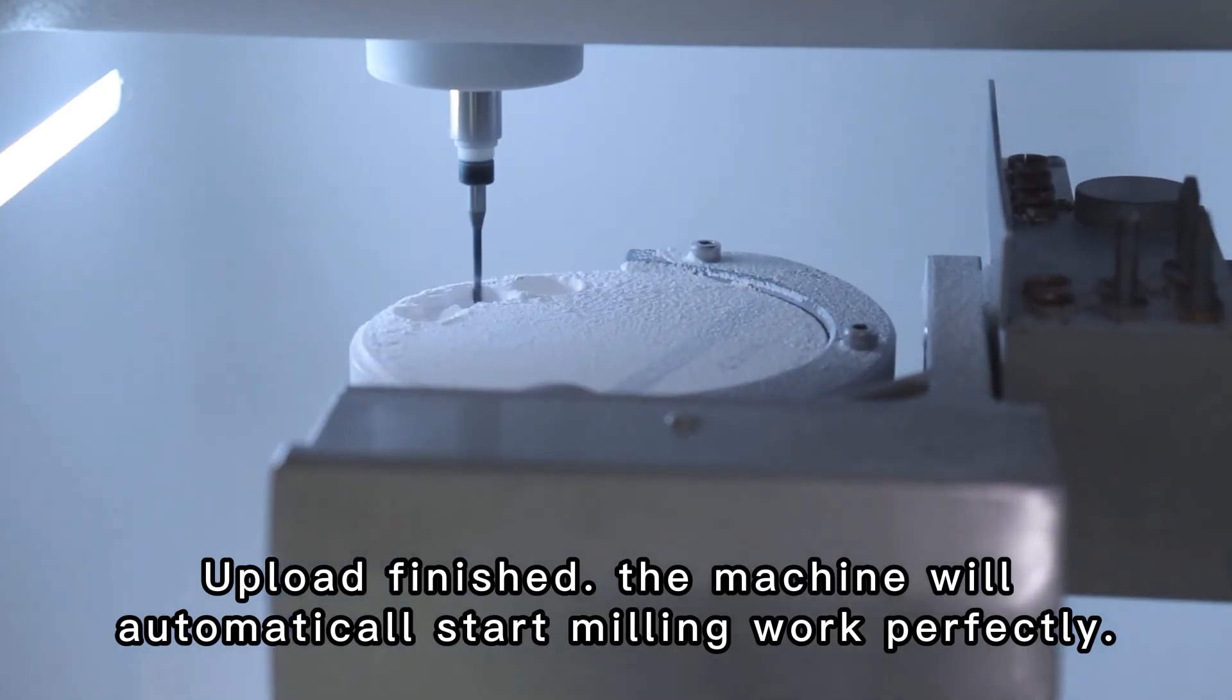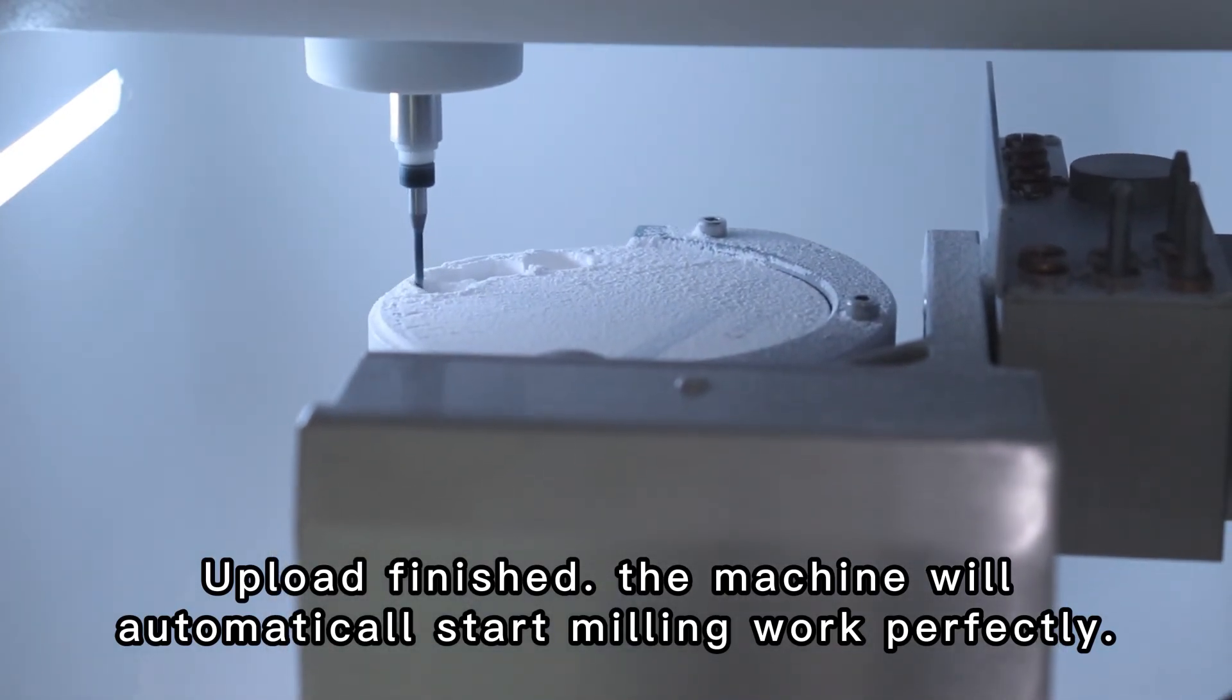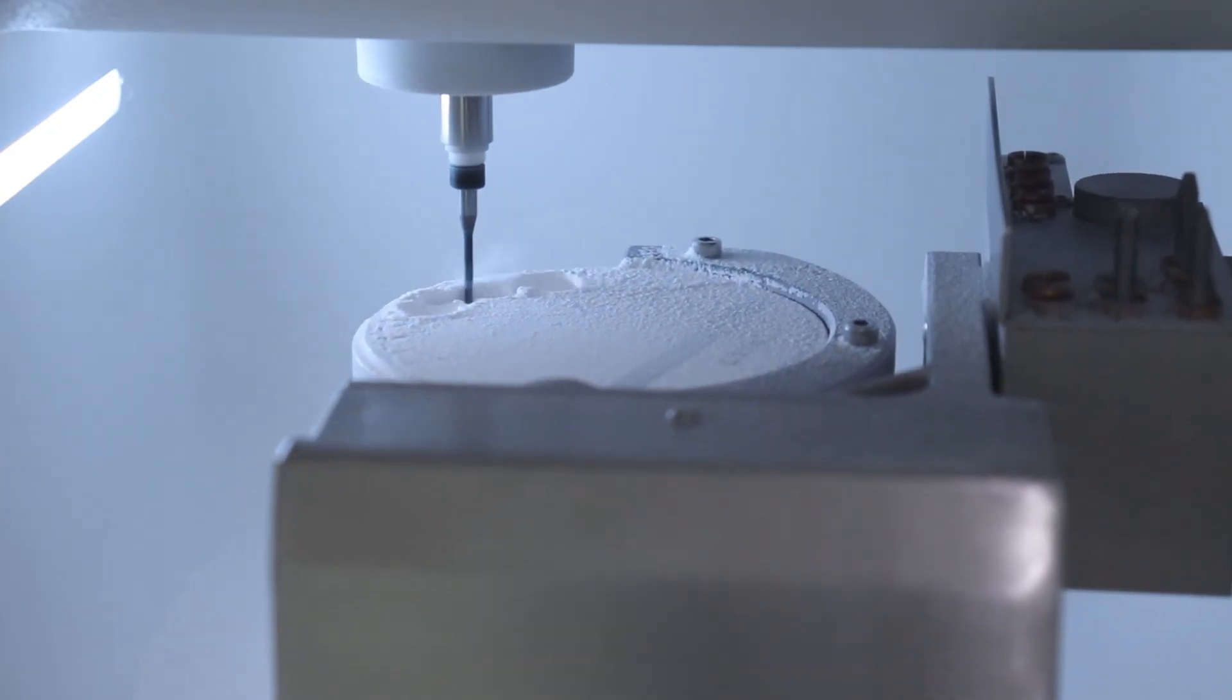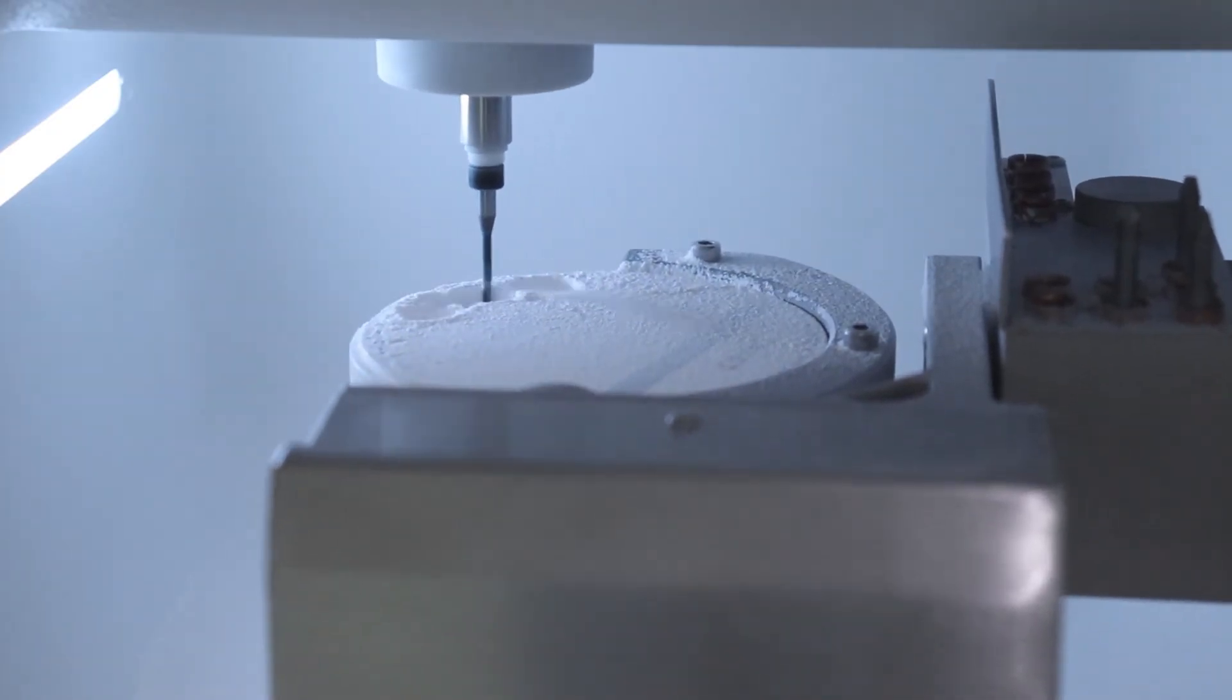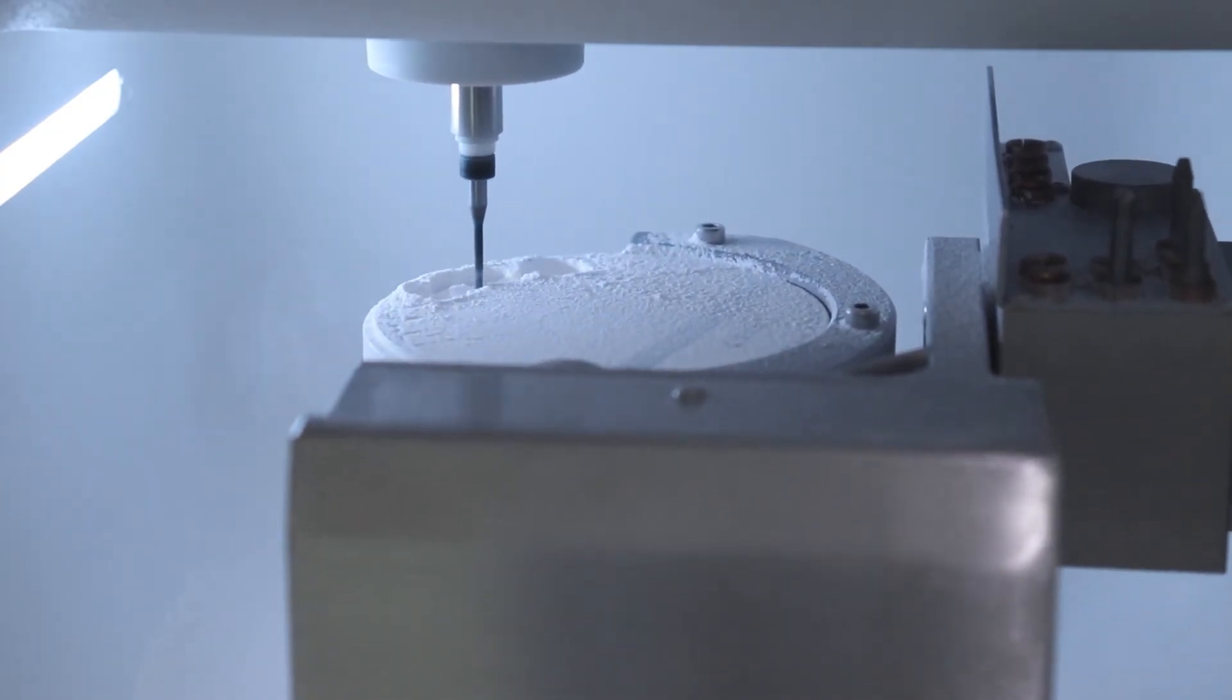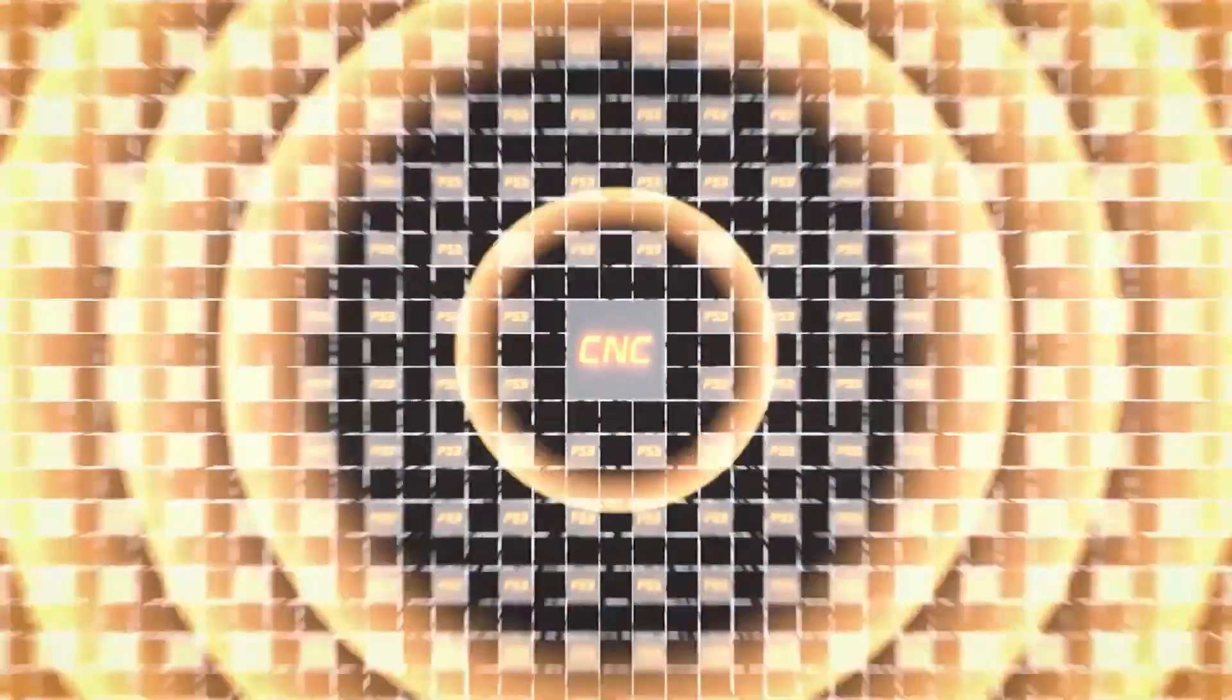The machine will automatically start milling work perfectly. Thanks for your patience.